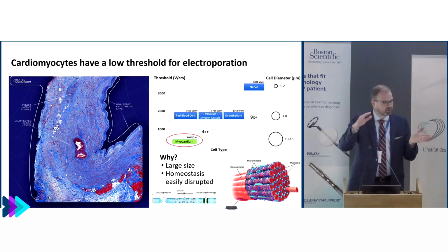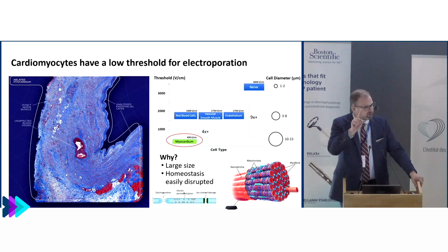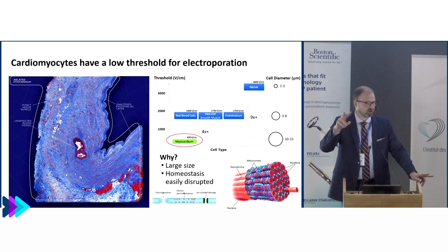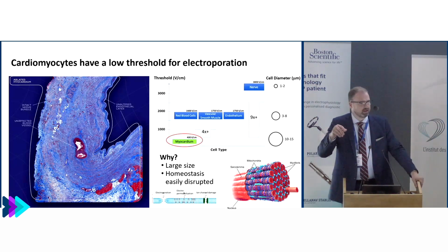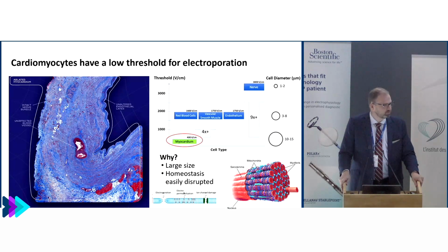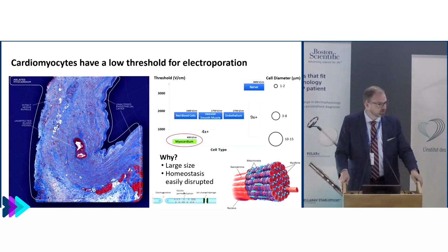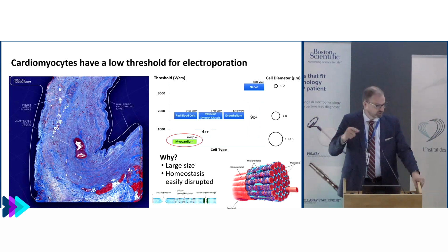It's basically between 300 and 500, but the interesting thing is, of course, if you give one single pulse, let's just call it a microsecond pulse, that's going to do nothing, right? So just saying that is already misleading, because you have to have done your job with the waveform to get that number. So it's very complicated. We're trying to get beyond the level of simplicity that we've been talking about PFA, especially this meeting has been great. So that is definitely a simplification, but it's helpful for the rest of the talk to keep that number in mind.